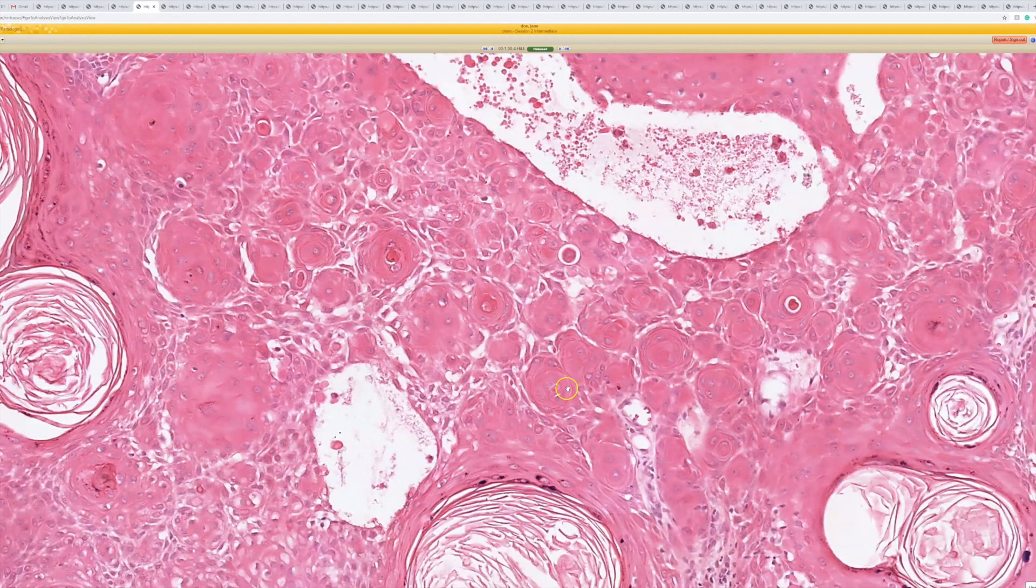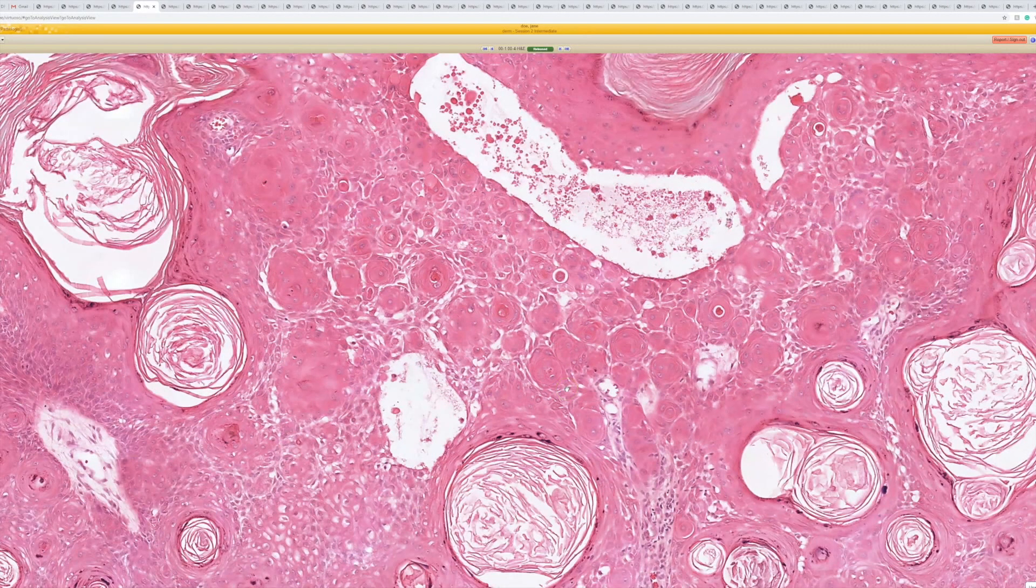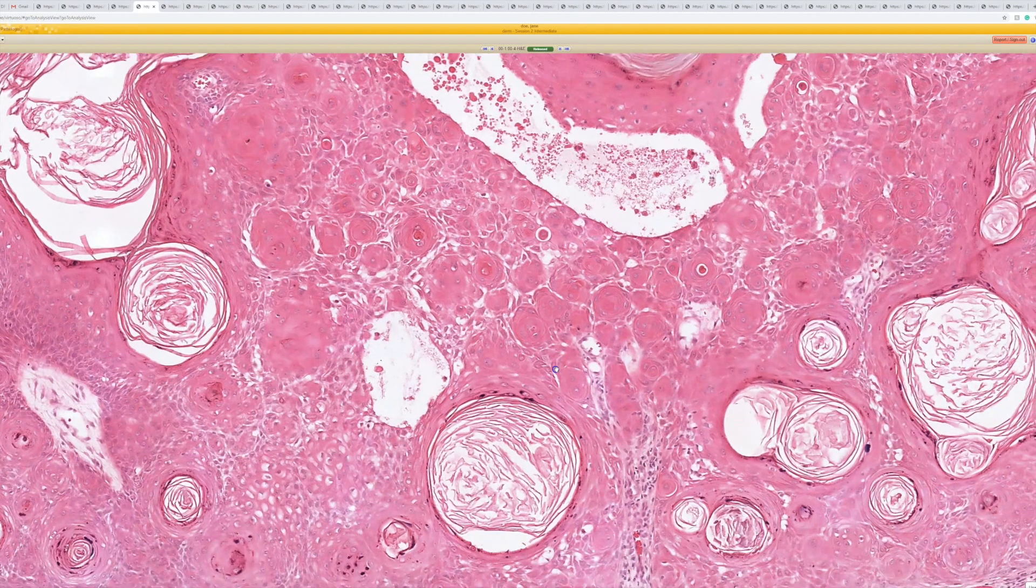And these have a lot of overlap with what other lesion that looks a lot like this? Inverted follicular keratosis. Yeah, IFK.